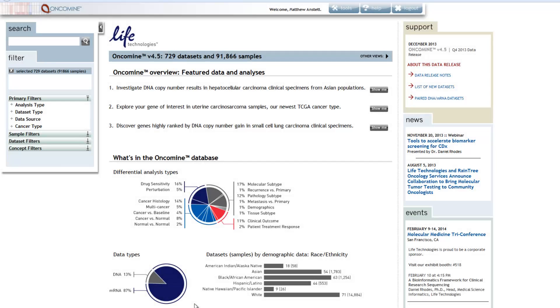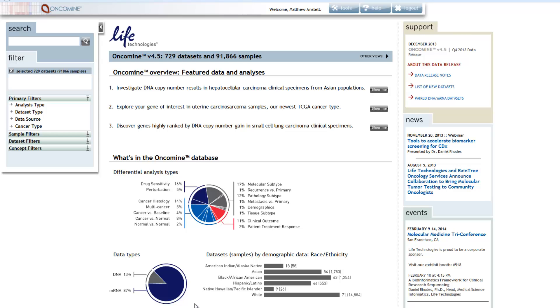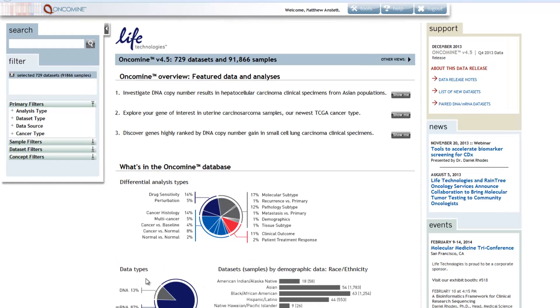The Oncomine Platform of Applications and Content are supported by the latest oncology research from investigators around the world. Data is carefully curated, analyzed, and made available over the web in multiple applications that help investigators identify patterns in genomic data related to cancer and potential response to treatment. To validate expression of a target such as vascular endothelial growth factor, a simple search can be performed across thousands of patients representing hundreds of cancer types in the Oncomine Concepts Edition application.